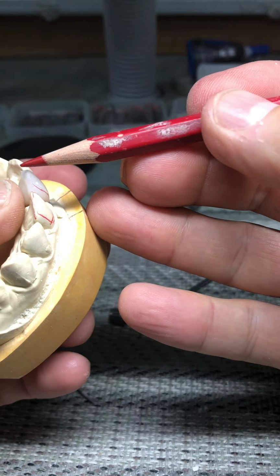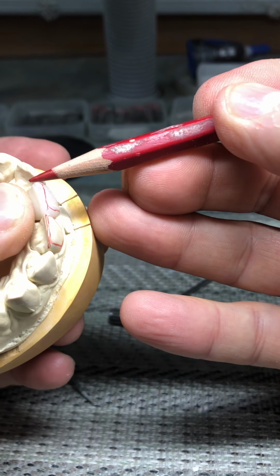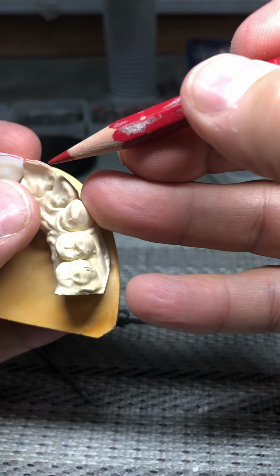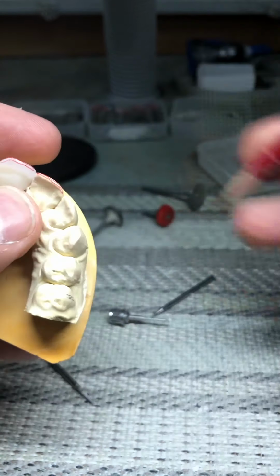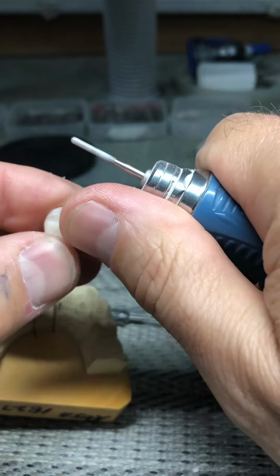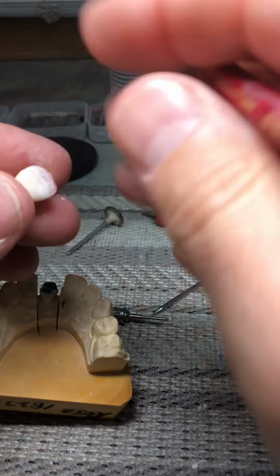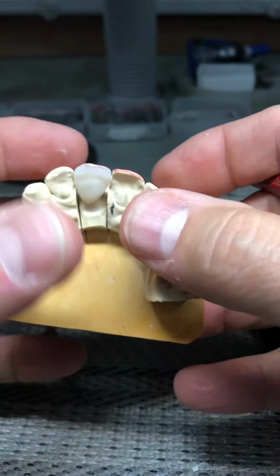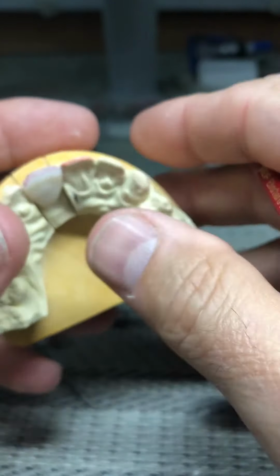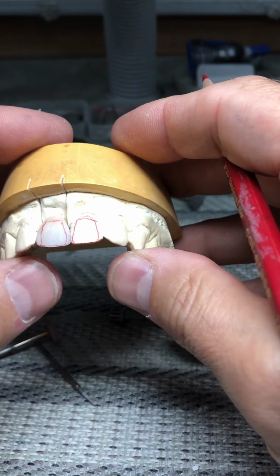If I evaluate the incisal edge, replace this marking. It's fairly thin. On the distal half, I still think this is too thick. I don't think it's an option, but I do look at it. So I'm just going to thin this off slightly. That's nice. Like that. Now I'm going to look at the facial contour.